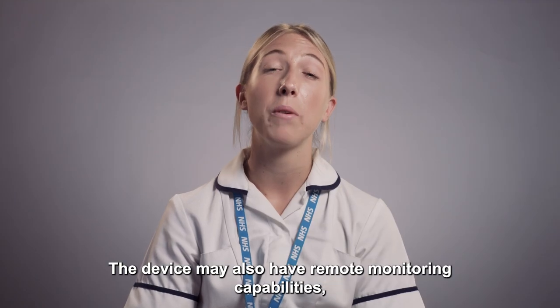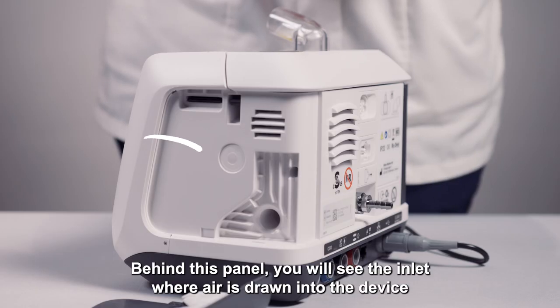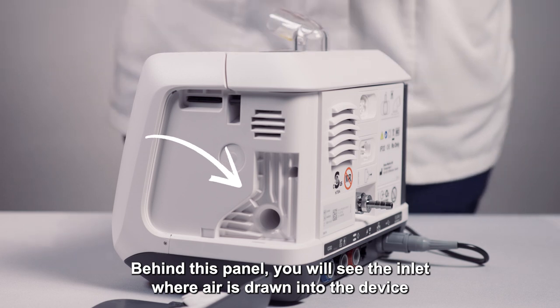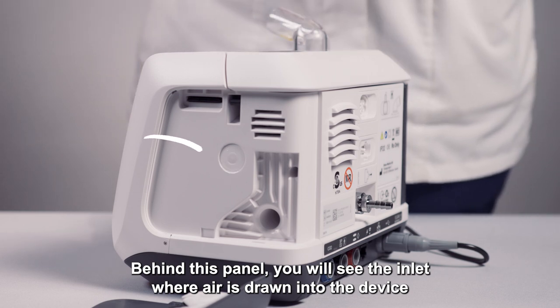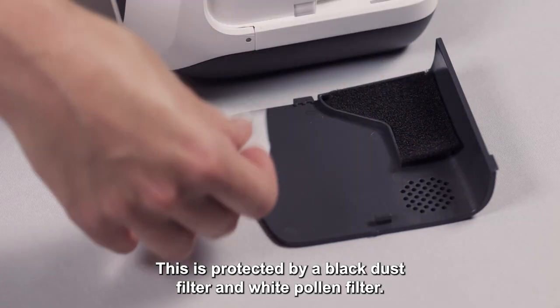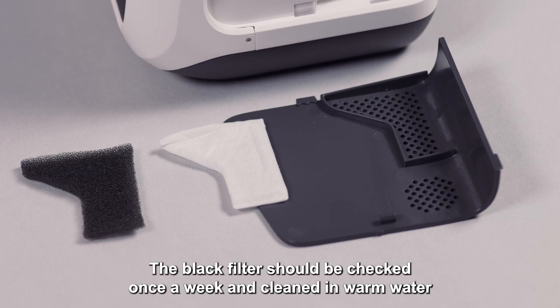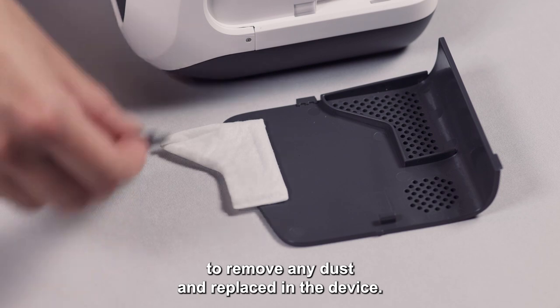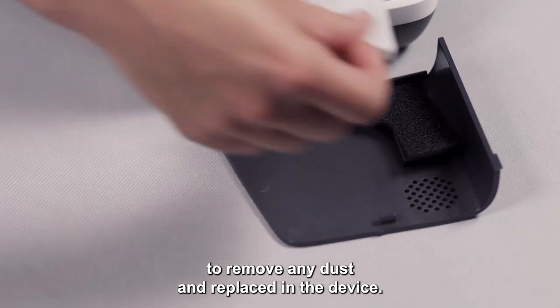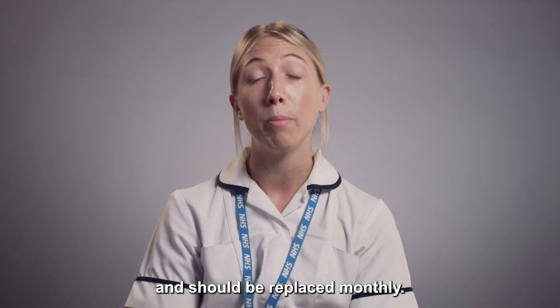The device may also have remote monitoring capabilities, allowing the team to review and make changes as required. Behind this panel, you will see the inlet where air is drawn into the device and this should not be covered. This is protected by a black dust filter and white pollen filter. The black filter should be checked once a week and cleaned in warm water to remove any dust and replaced in the device. The white filter is not washable and should be replaced monthly.